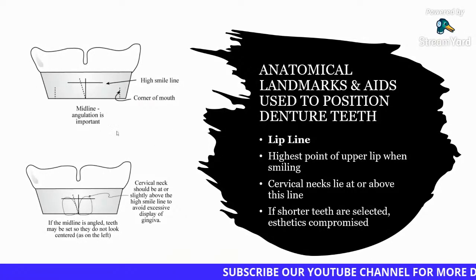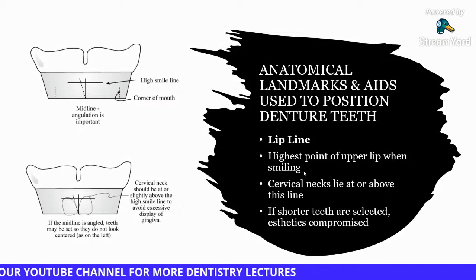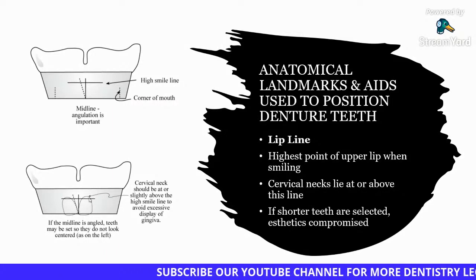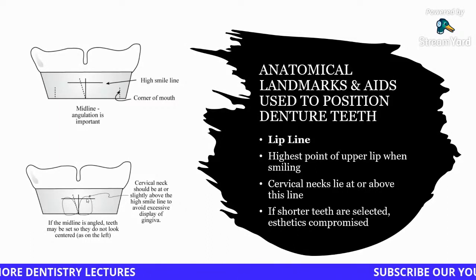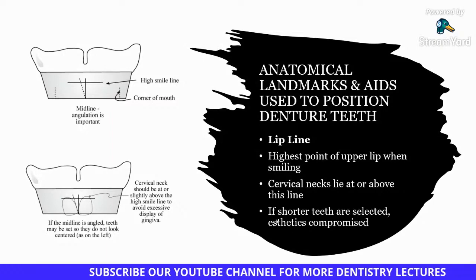First of all, the lip line. It is the highest point of the upper lip when the patient is smiling. The cervical necks should lie above that line. This is a very important point, otherwise it will look very unaesthetic. Secondly, the teeth should not be occlusogingivally short in size. If they are short, again the aesthetics will be compromised.